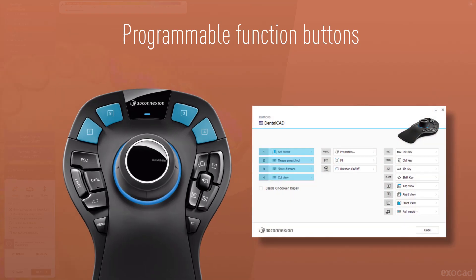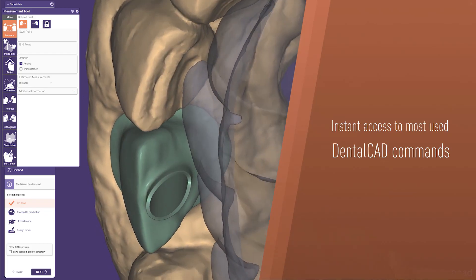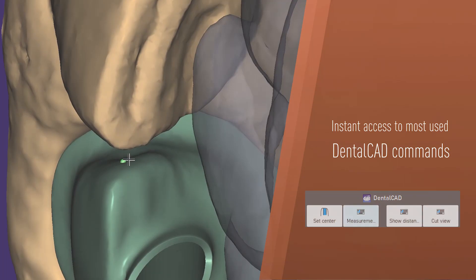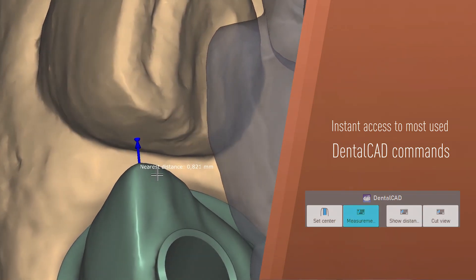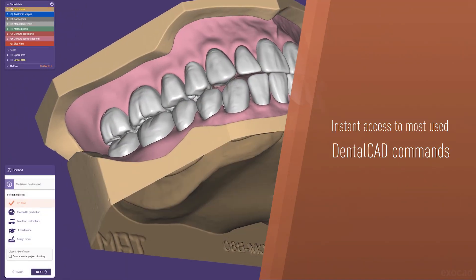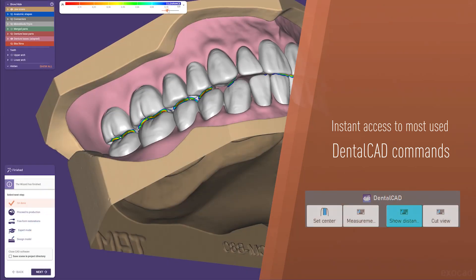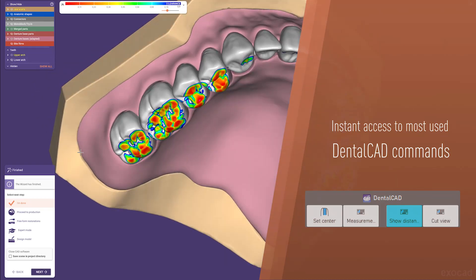Speed up your workflow with the 3D connection buttons. Use the Dental CAD commands to streamline common tasks — for example, quickly measuring the distance between a tooth and the implant you plan to create. The Show Distance feature helps you monitor and verify tooth spacing for both jaws in a clear graphical format.